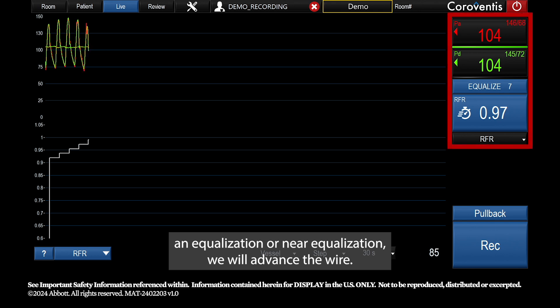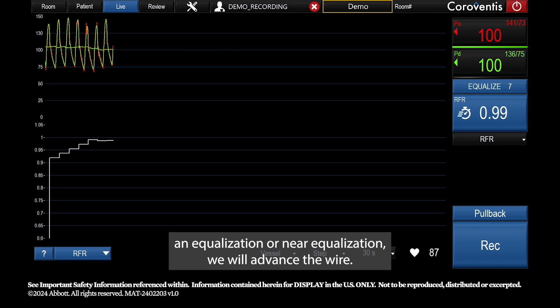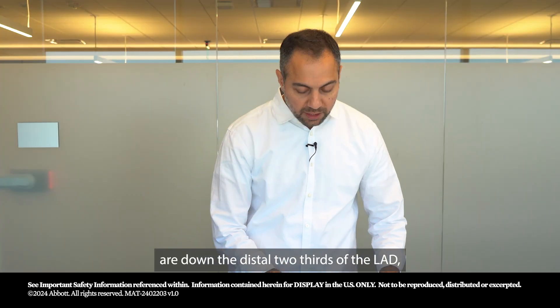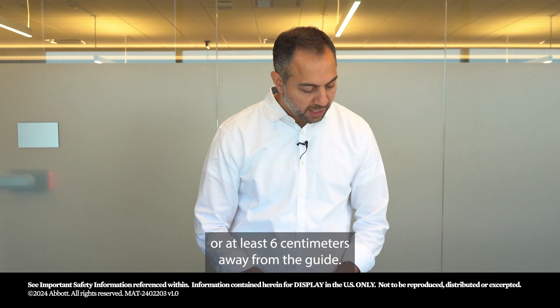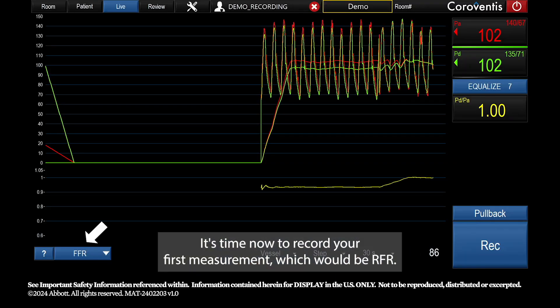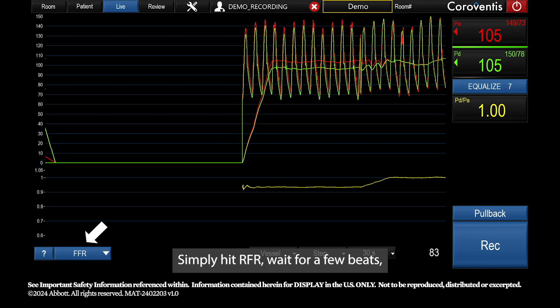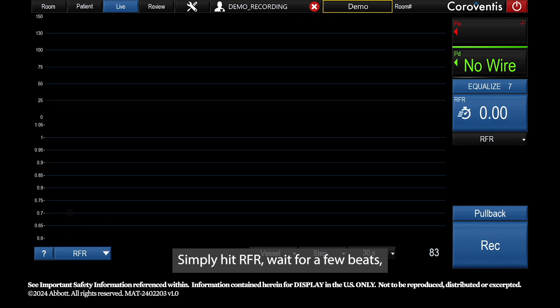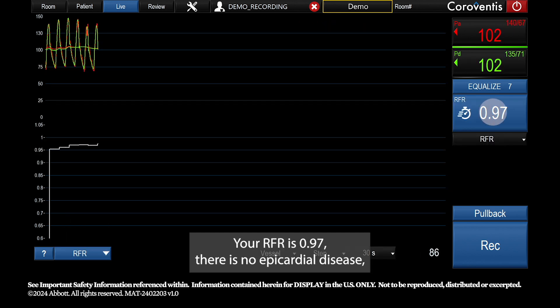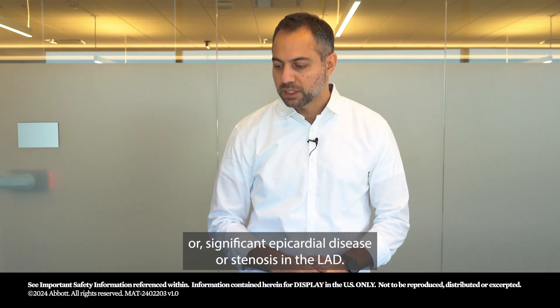Once we get that value to reach equalization or near equalization, we record and advance the wire. Now we are down the distal two-thirds of the LAD, or at least six centimeters away from the guide. It's time to record your first measurement, which is RFR — simply hit RFR, wait a few beats, and here we go: your RFR is 0.97.